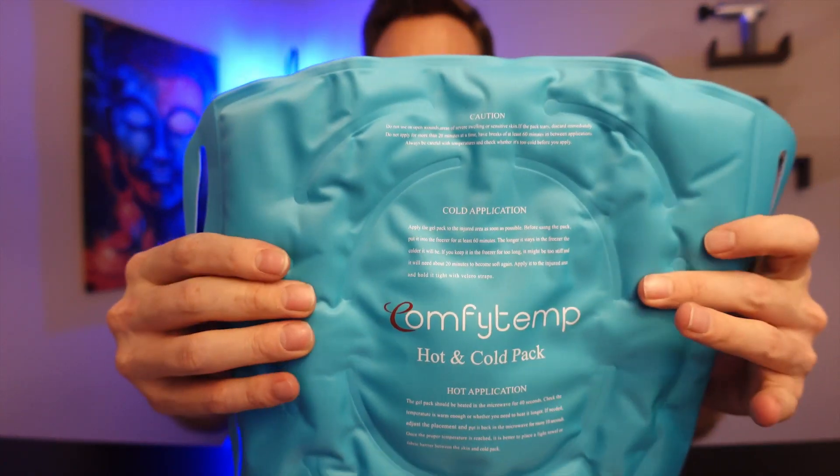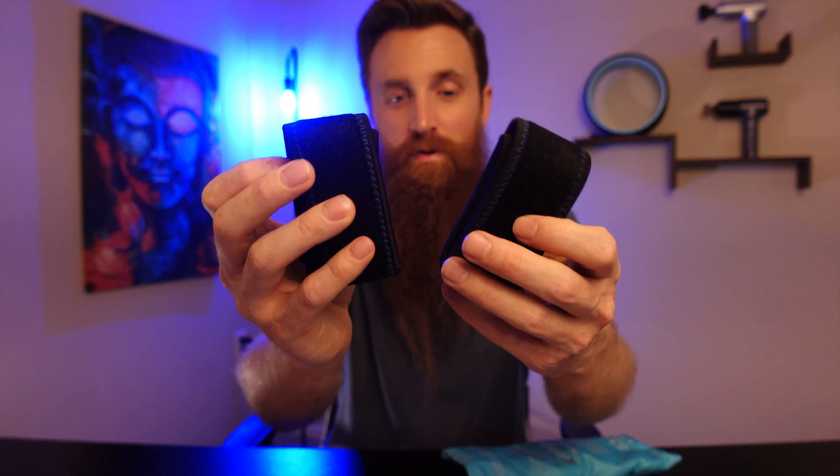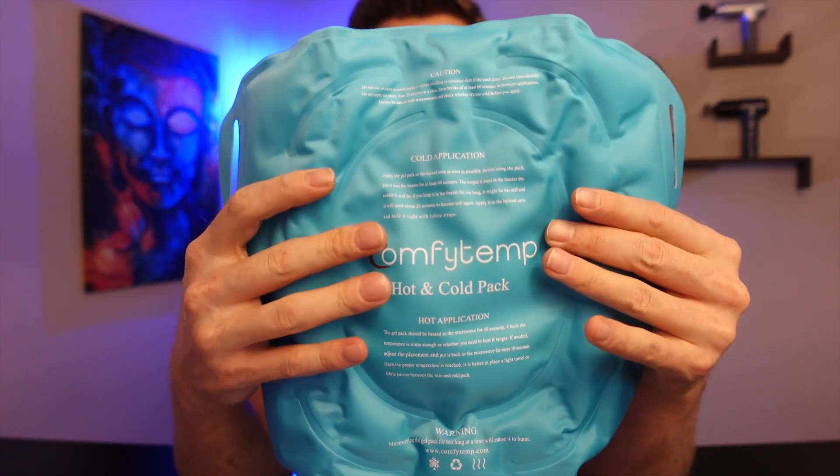Let's go ahead and open this up. Here's what comes in the package: you're going to get the ice pack itself, and then you are going to get two removable straps as well. These aren't fully attached to it.